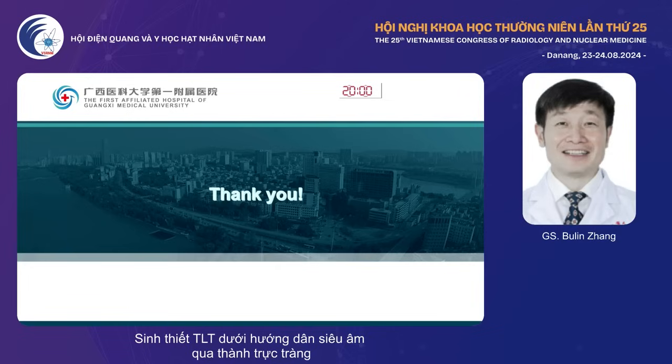Advantages of transperineal prostate biopsy: reduces the risk of infection by avoiding the rectum, and ease of detection of anterior tumors with the transperineal approach. Cost-effective, quick, avoids antibiotics, high cancer detection rate. Anterior tumors can be detected in this biopsy.